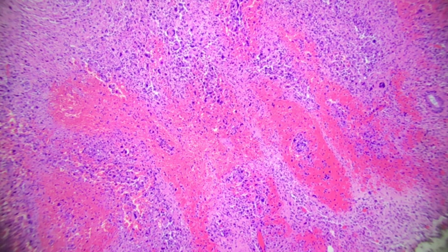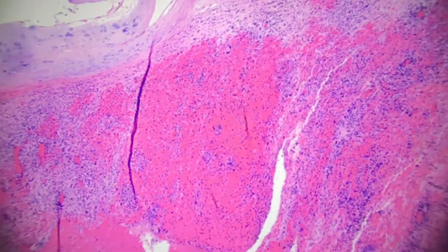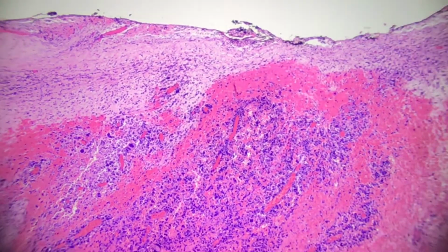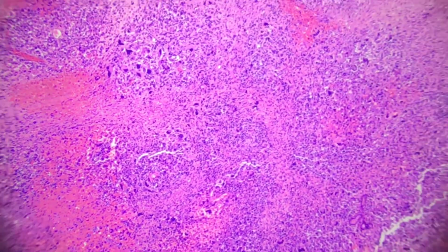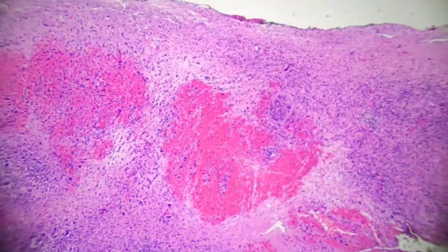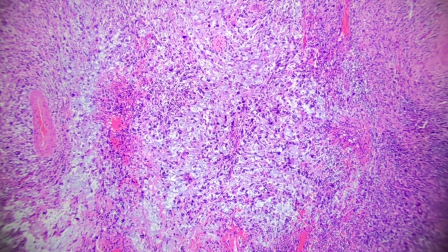They will have LVI, or lymphovascular invasion. You can see perineural invasion, and it doesn't really matter which piece I go to in this case. You're just going to see the same sea of these atypical blue cells. So just to give you guys an appreciation of the depth of that. And one of the other things that you may see, and these are sometimes called specifically the desmoplastic melanomas, is desmoplasia. So if you bear with me, there's an area up here where we can appreciate more of that desmoplasia.